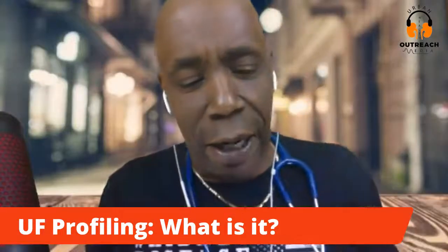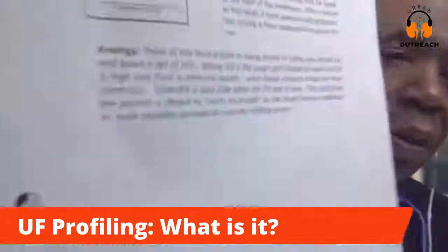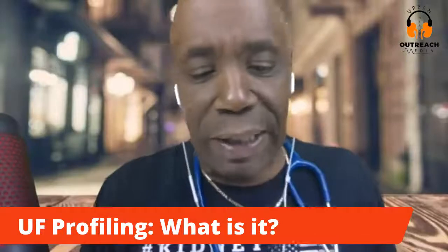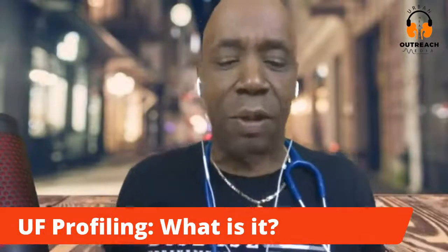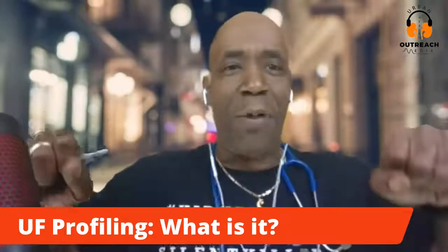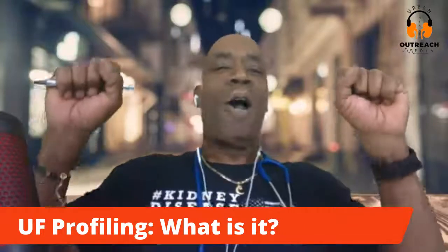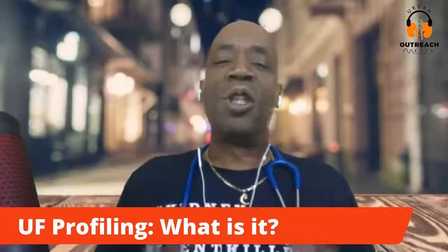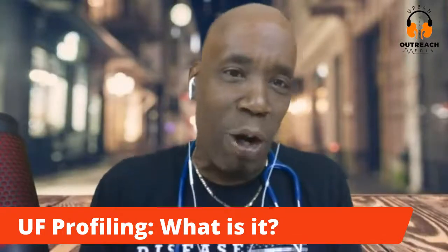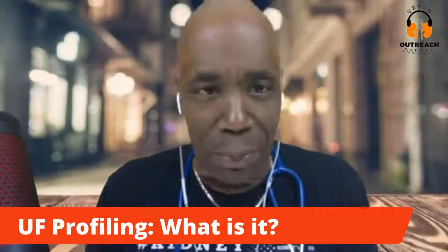So, think of the analogy of this third profile that I just showed you. You want to look at it as being similar to riding your bicycle up and down a set of hills. You know what I'm saying? You're at the gym, you're going up, and then you go down. Up is hard, down is easy. When you go up, you're pulling a lot off. When you go down, you're not pulling much off.